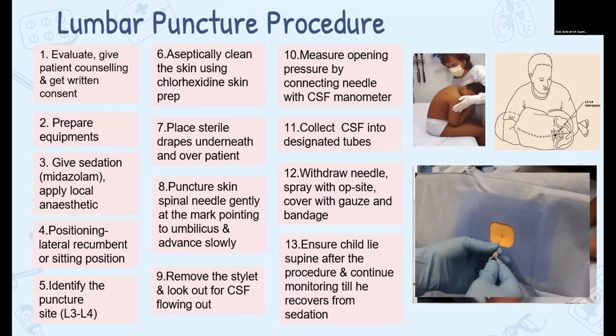Then we measure the opening pressure by connecting the needle to the manometer. Then we collect the CSF into the designated tubes or bottles. Usually, we use 4 bottles and approximately 1 ml per tube.